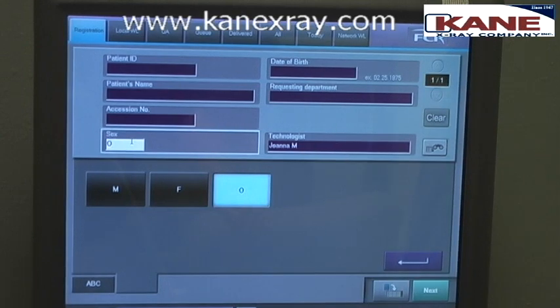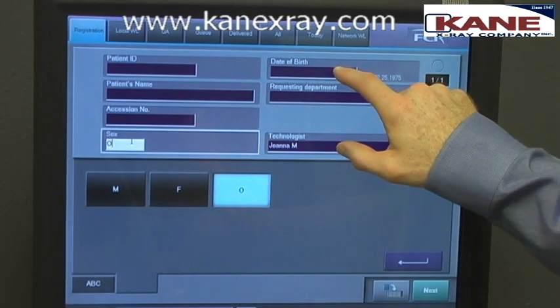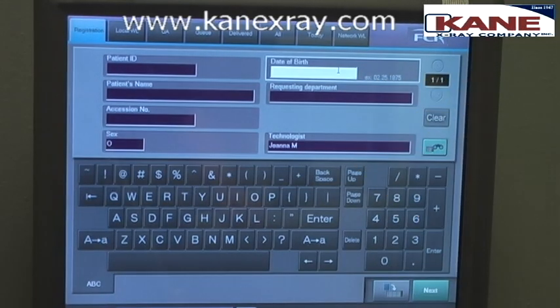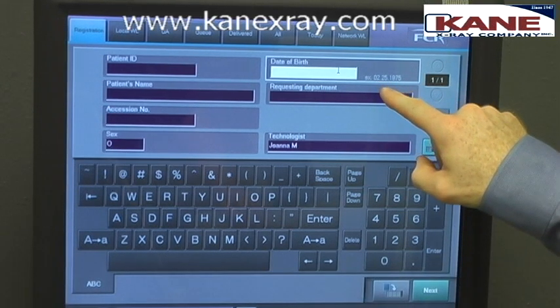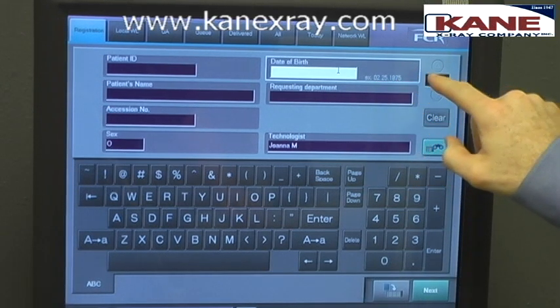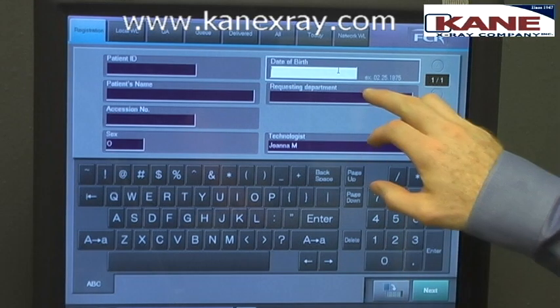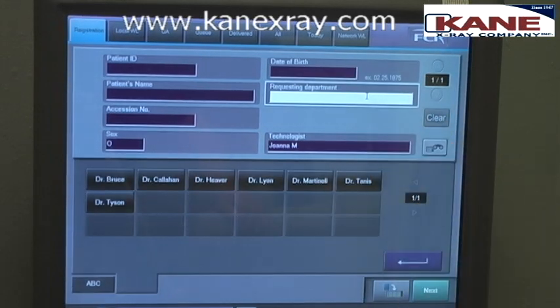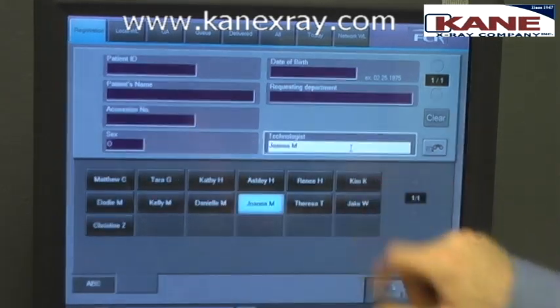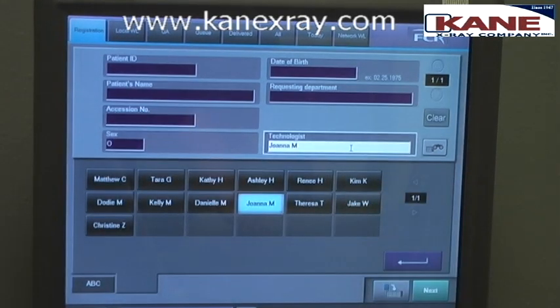Sex is the male or female sex of the patient. Date of birth, just like the example shows, is entered as MM.DD.4Ys. Requesting department is whichever doctor ordered the exam, and technologist is whichever technician is taking the exam.